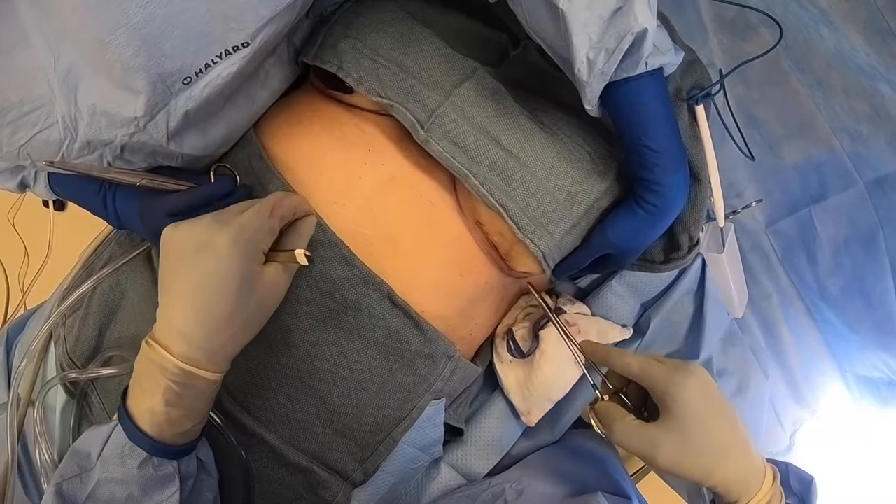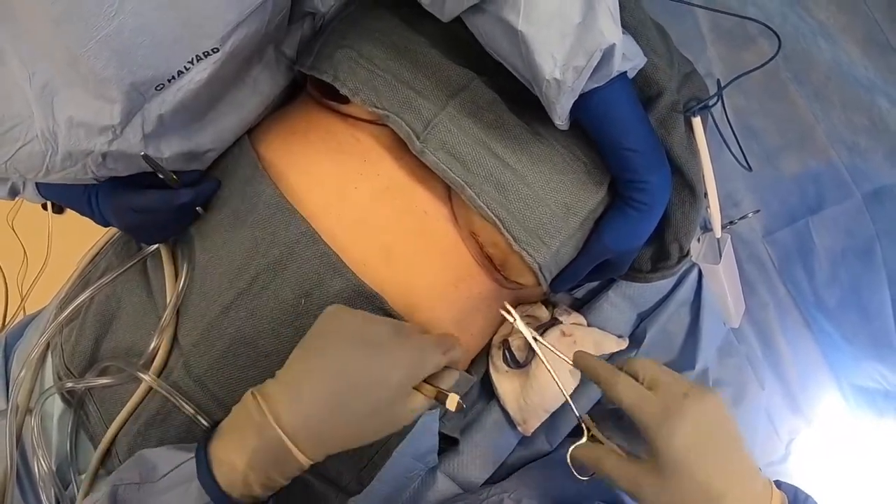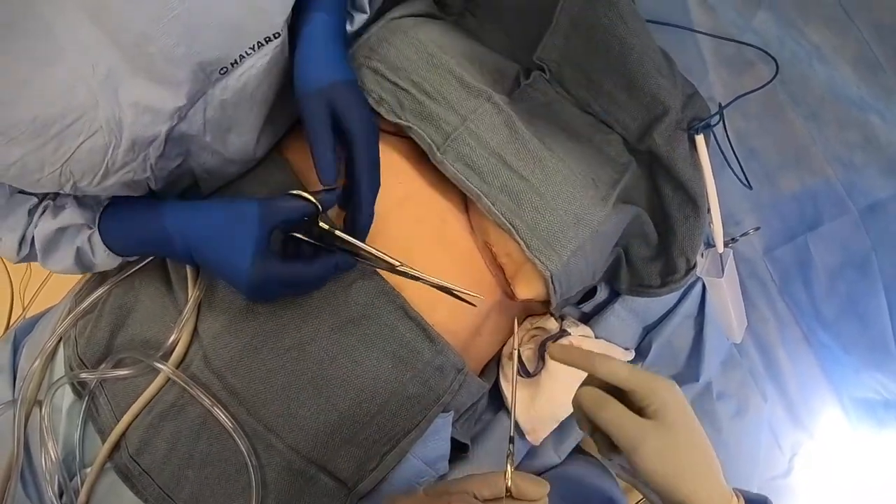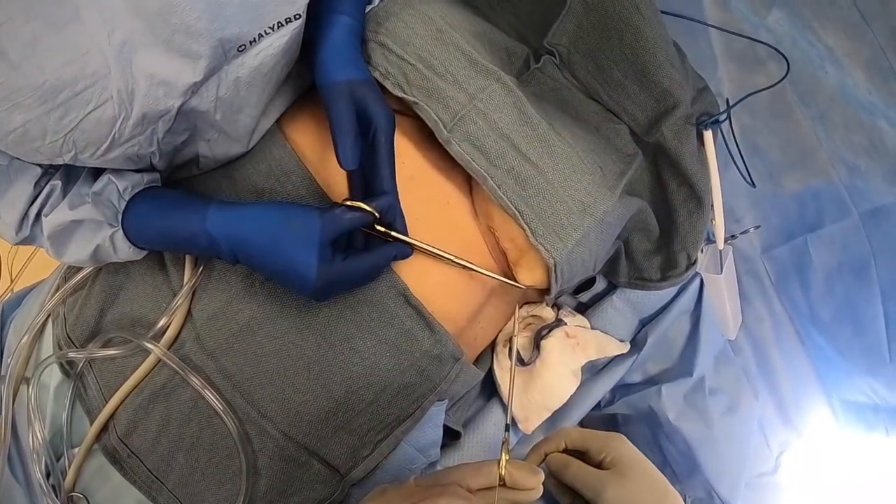The knot is going to be buried. I generally do about four throws, and then she's going to slide one time down, feel the knot, and cut.